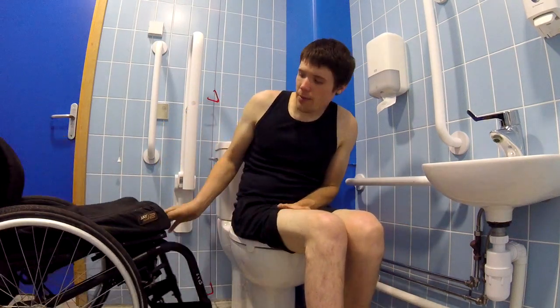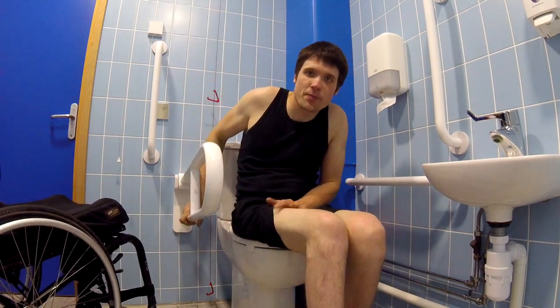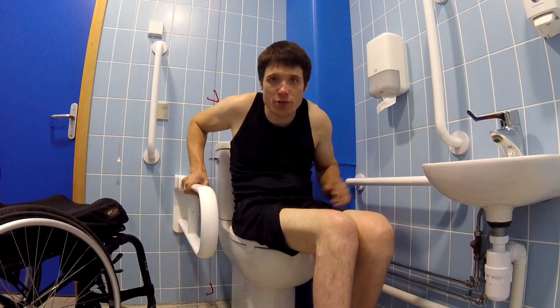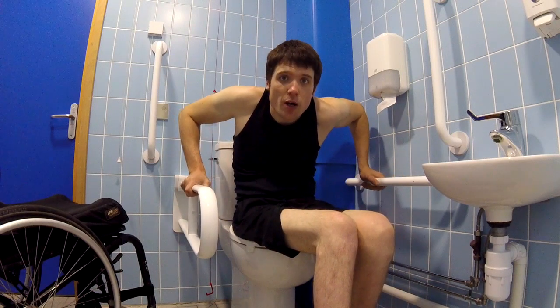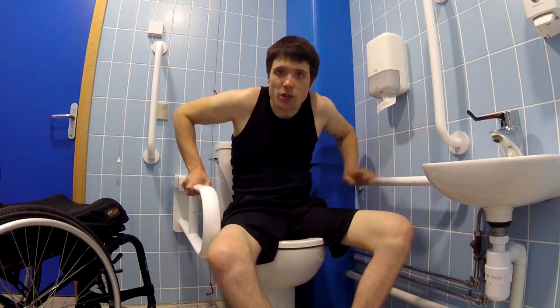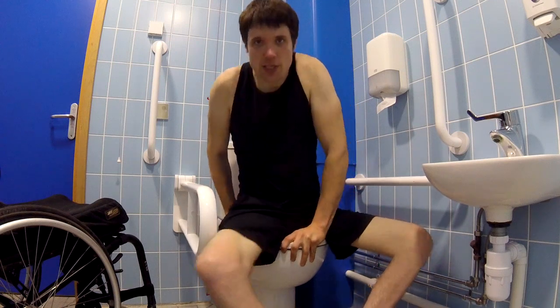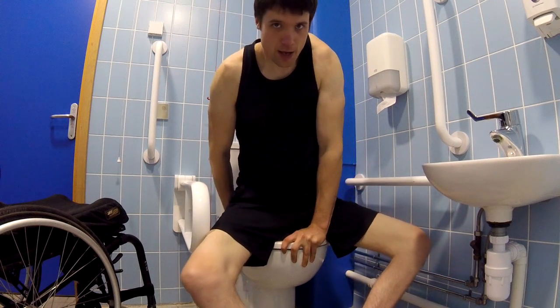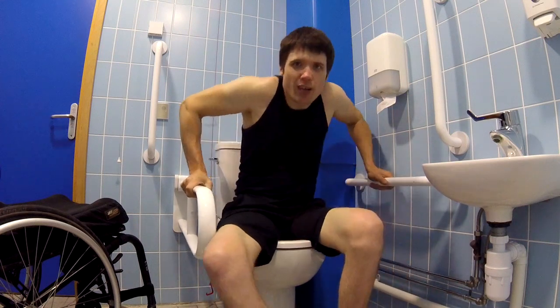Now I'll move my chair out of the way and bring this bar down, particularly for pressure relief reasons. It's really easy to grab both these bars and lift yourself up if you're going to be on the toilet for a long time. How I would usually do it is to grab the seat and lift — the same difference really, but this one is just a little bit easier.